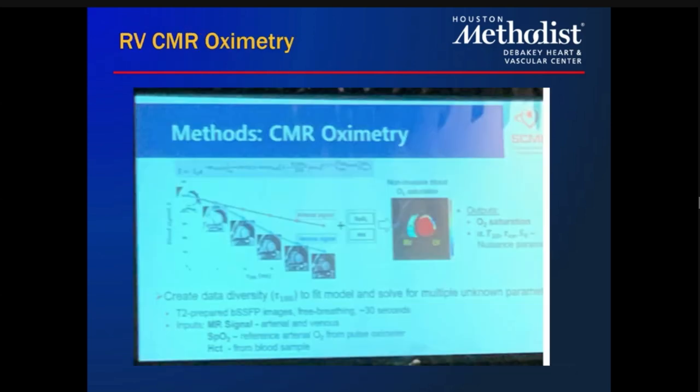Okay. One exciting thing, sorry for the potato quality image: a couple of years ago, I was excited when one CMR researcher, a clinician, presented a virtual CMR oximetry where they were able to do T2 prepped imaging techniques to quantify differences in the O2 sat levels of the RV, LV, and different blood compartments. So people are working on that, and hopefully we can provide an initial non-invasive oximetry run. That's on the horizon and very important in congenital patients with their RV, PA, and RA issues.